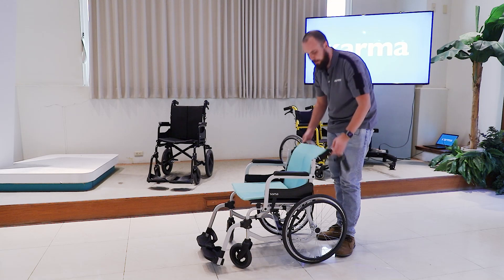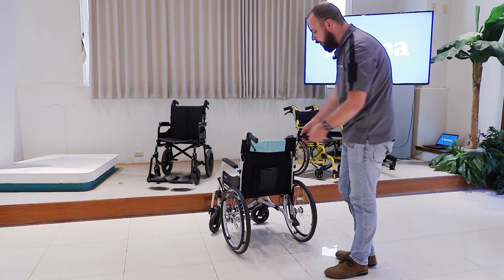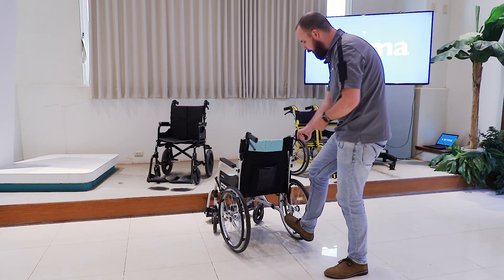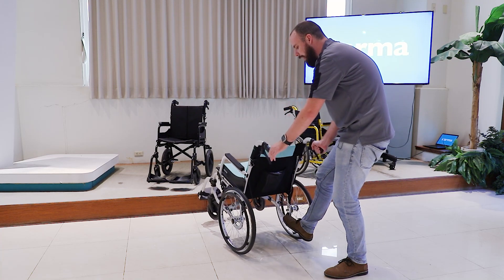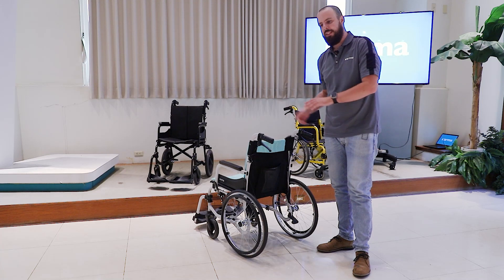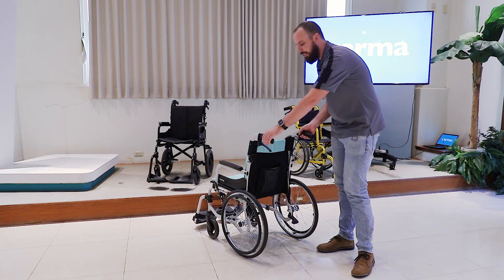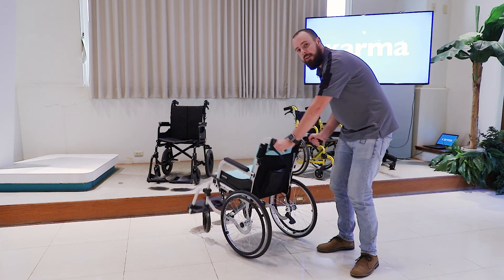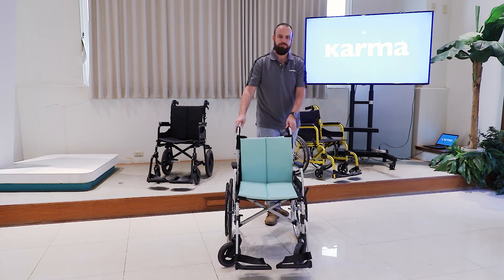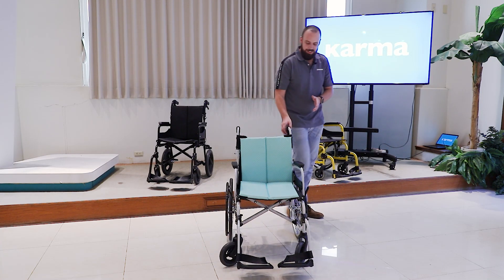Finally, we have an attendant tipping lever at the bottom. When an attendant is pushing the chair, they put their foot right on here and it assists them in overcoming any step or obstacle they're approaching. This makes it a lot easier to move the user around, and the user won't experience any sudden movements that you'd get from just using upper body strength.